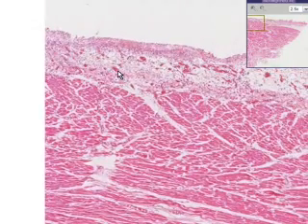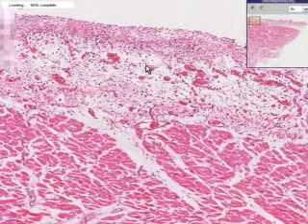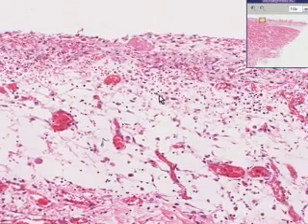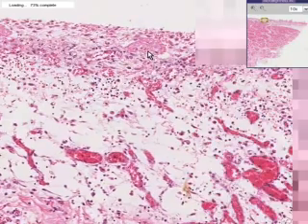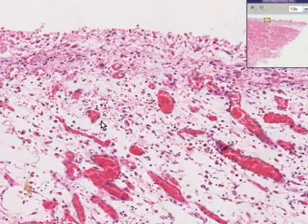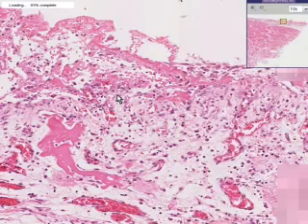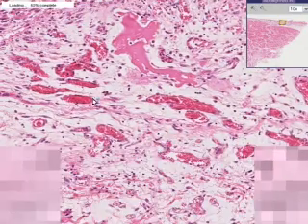However, when you get to the edge of it, which is supposed to have a fairly thin layer of visceral pericardium, you see a thickened layer. In that thickened layer you see a lot of engorged blood vessels, a lot of acute and chronic inflammatory cells within this pericardial layer. In addition to that you see some little pieces of granular fibrinoid material, as well as dilated vessels and infiltrates of cells.